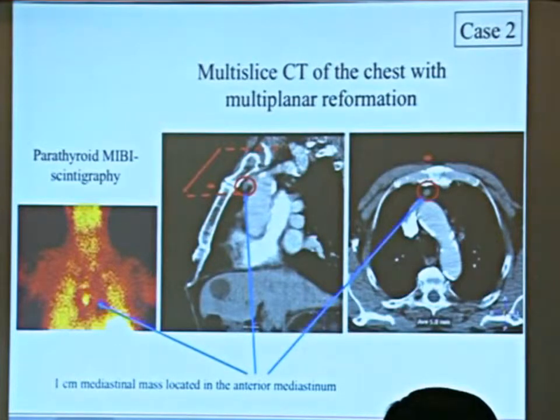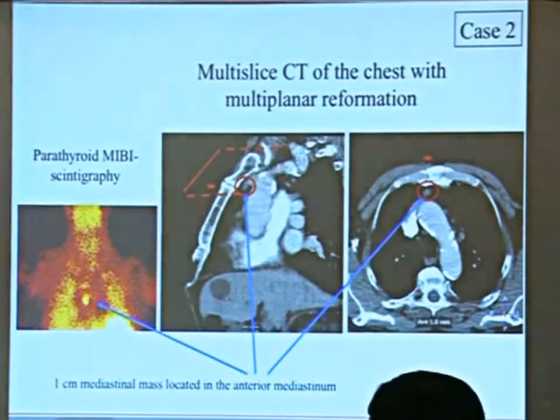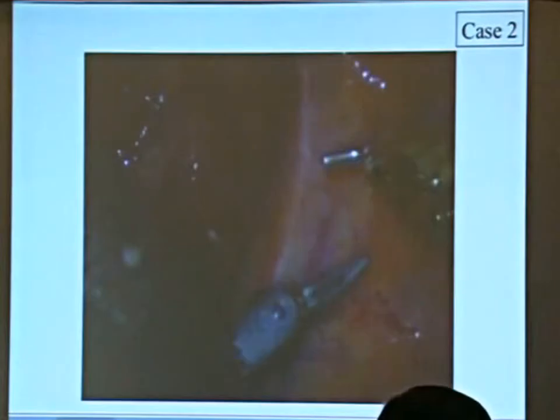And now again with a robotic Da Vinci system, you may, as you know, focus and fix the position of the camera and then the instruments exactly to that position, which is an advantage as compared to any trial of handmade positioning. And I admit I did not find the video, which is 3 minutes.